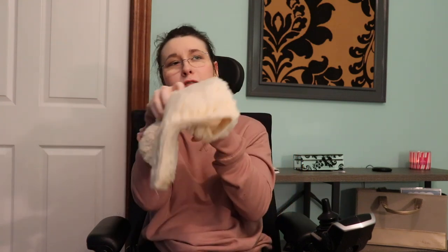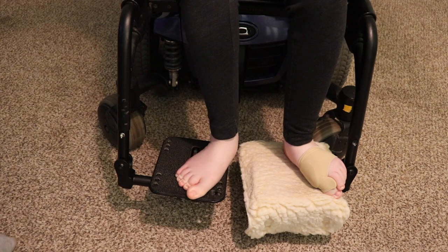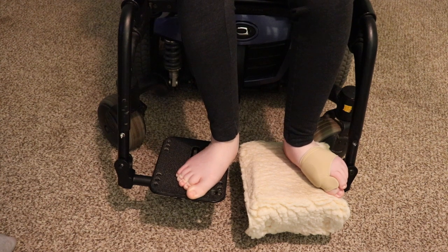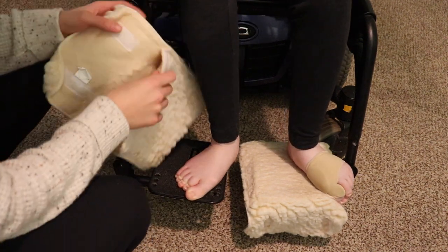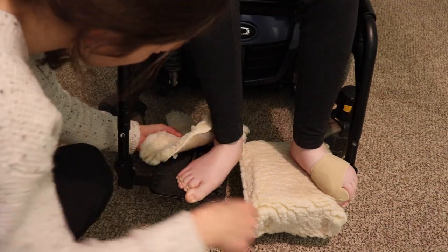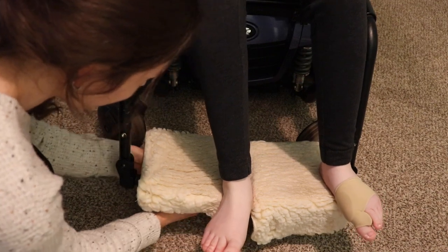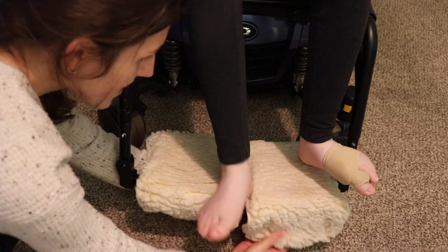I'll link everything down below. I do have two pairs so we can always switch them out if one gets dirty. I'm very picky about how they are put back on. Basically, I like them to be tucked underneath. Lift those feet - okay, see, you're already the best learner! I'm picky about this, so moving right along.